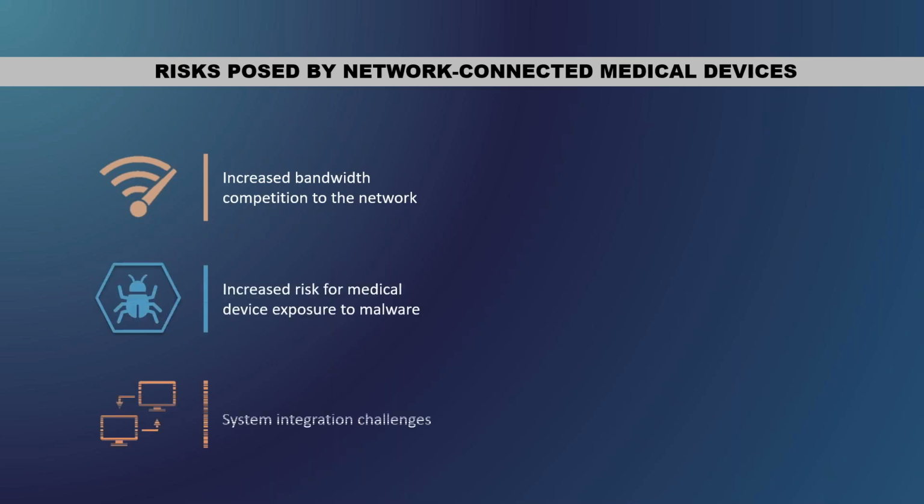Okay. So first off, the risk posed by network-connected medical devices: increased bandwidth and competition on the network. Hospital data infrastructure needs to be adequate to support increasing bandwidth demands.